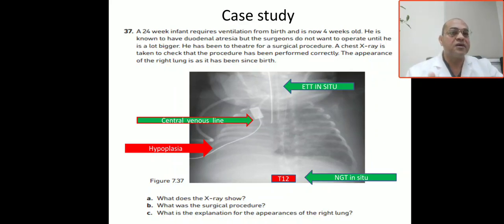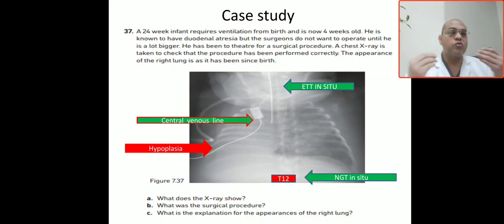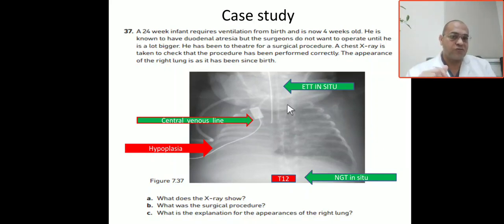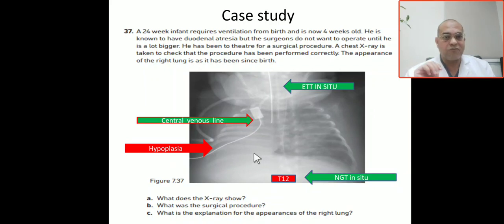The right hemithorax shows white-out — no aeration at all. Regarding what the X-ray shows, we comment on the lines. There are three lines (shown in green). The first is the ETT, which is in the correct position in the trachea. The NGT goes from top down to the stomach and is also in the proper position.